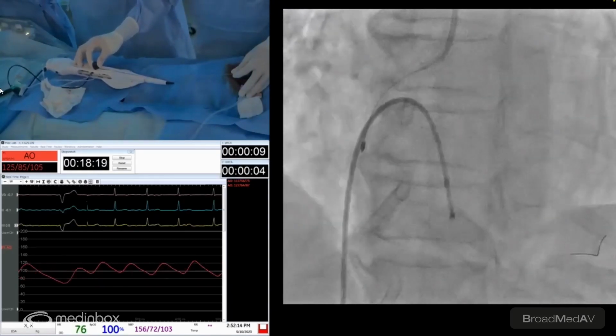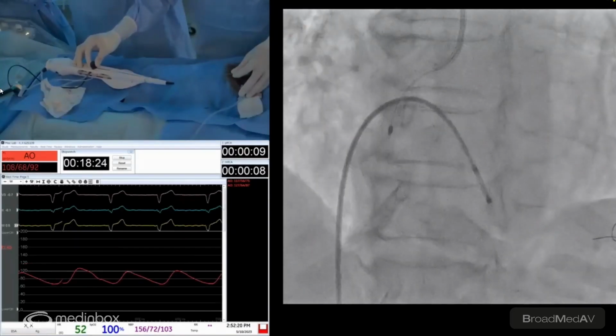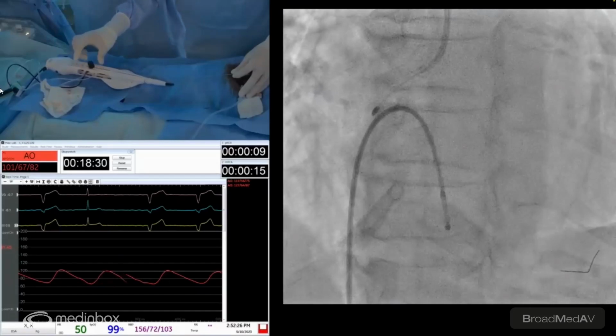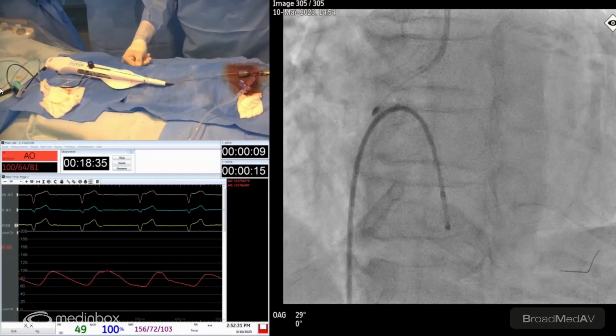So the burr, if you can notice, it's advancing slowly in the lesion. The sound is better. We don't have any decelerations, maybe 5,000 at some point. We can still hear a bit of resistance. We can still hear the resistance. 168 minimum.